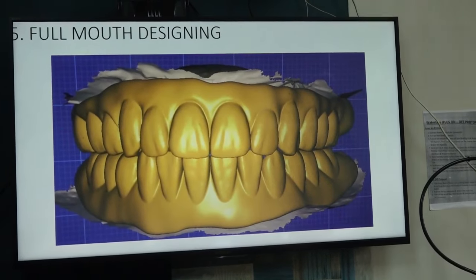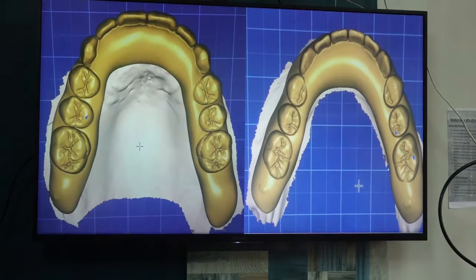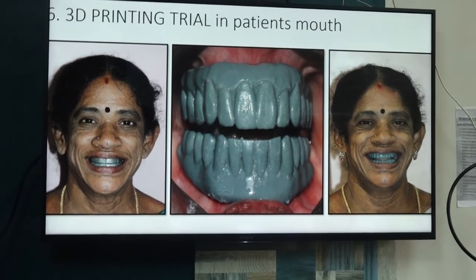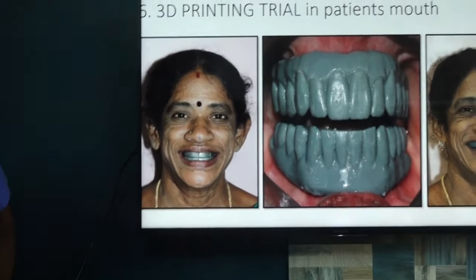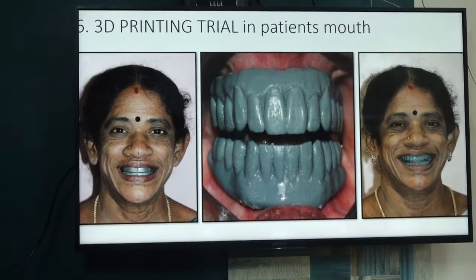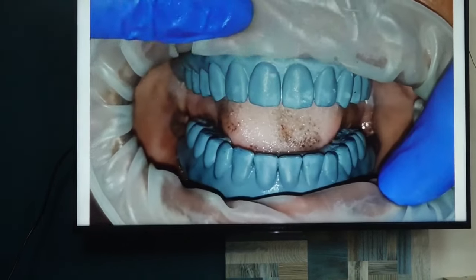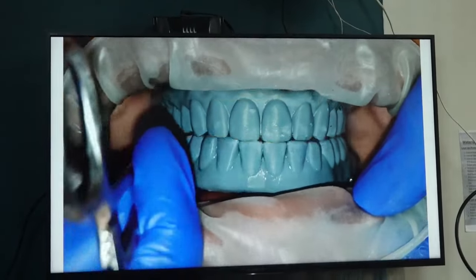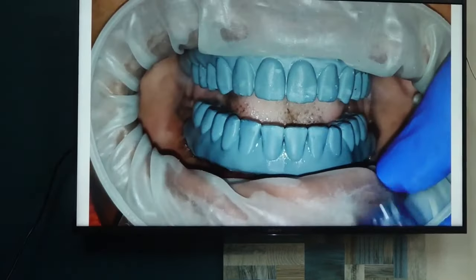Next. Then comes the designing part. Okay. Next. Now you convert that design into STL file and print in the printer. Either white or this grey color. Then you try that intraorally. You do any necessary modification. But comparatively 3D printing trial is quite easy only, because from the first step digital protocol it will be accurate.